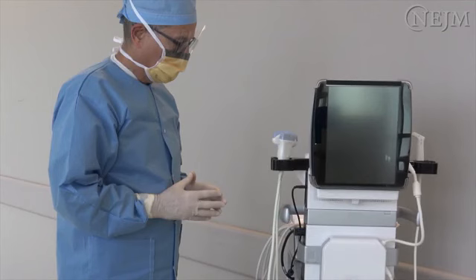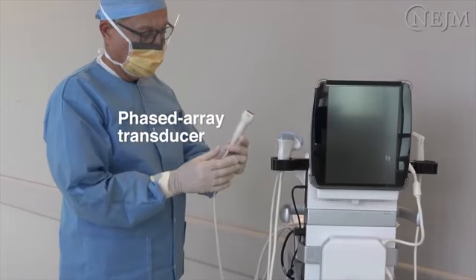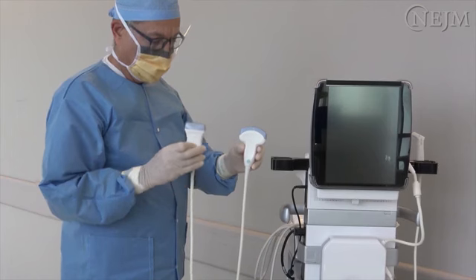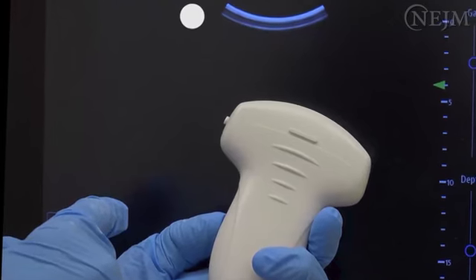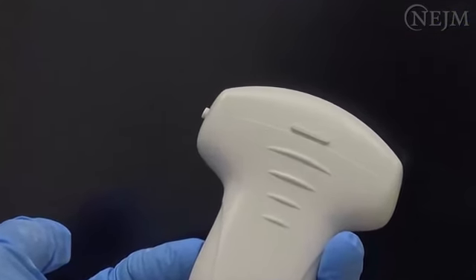During EFAST, examination of the thorax, abdomen, and pelvis for the detection of free fluid should be performed with a low-frequency curvilinear or phased array transducer. Examination of the thorax for the detection of pneumothorax can be performed with a higher frequency linear or curvilinear transducer. In this video, a curvilinear probe is used to demonstrate all aspects of the EFAST examination.